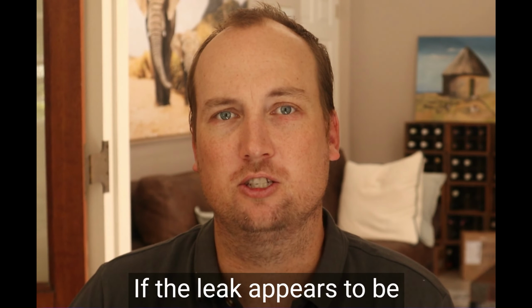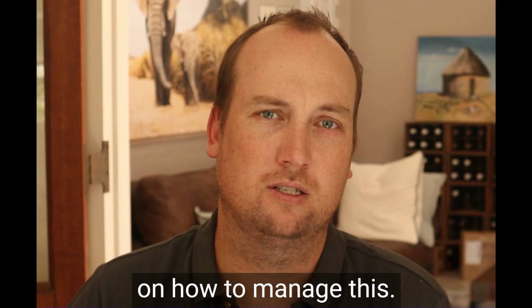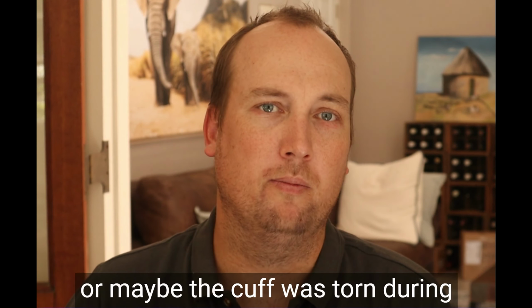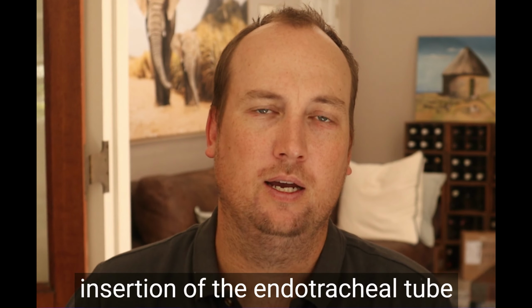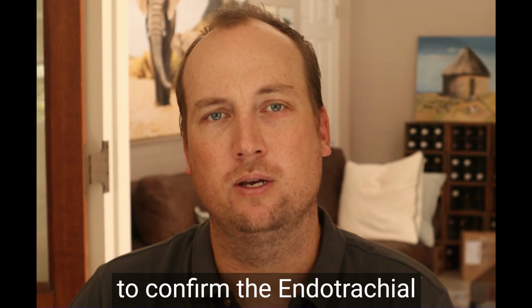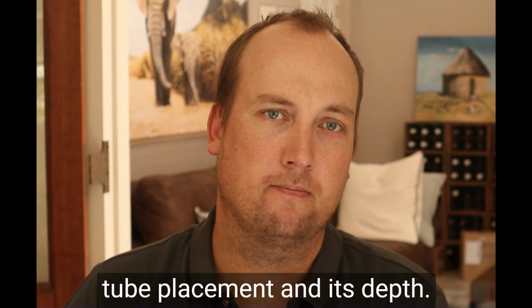If the leak appears to be coming from the airway, then there are a few options on how to manage this. If it's an endotracheal tube, I can check the cuff pressure. Maybe the cuff is underinflated, or maybe the cuff was torn during insertion of the endotracheal tube, and that's the cause of the leak. I can also re-perform laryngoscopy to confirm the endotracheal tube placement and its depth.